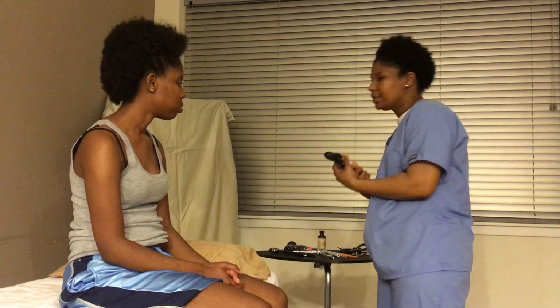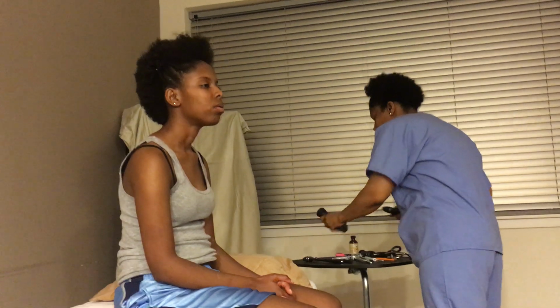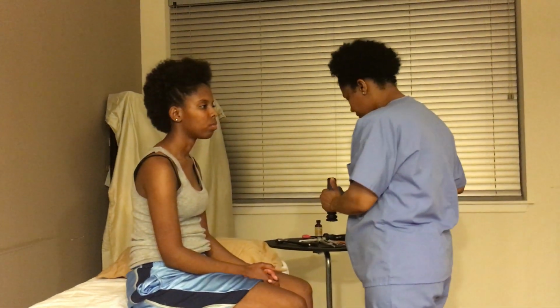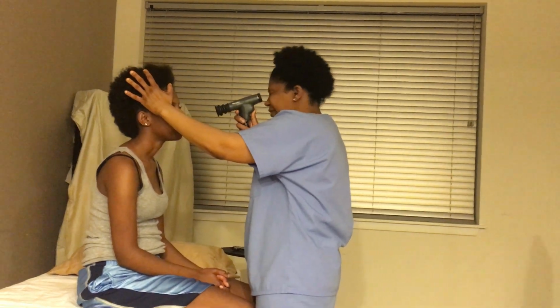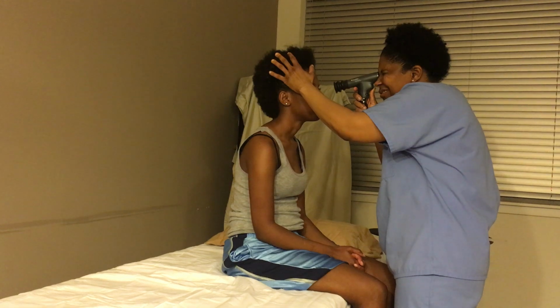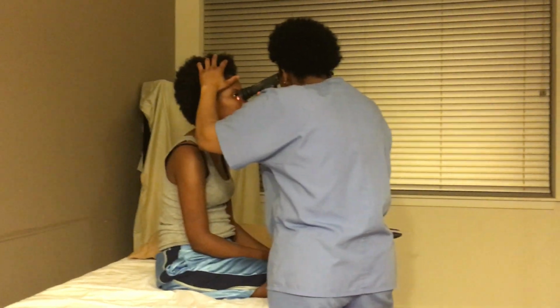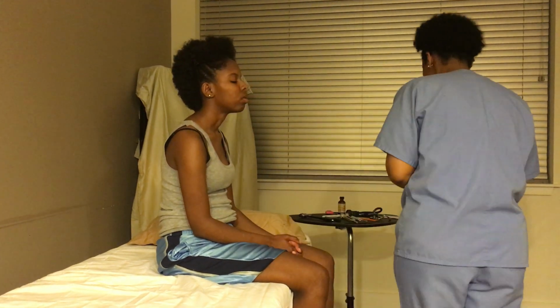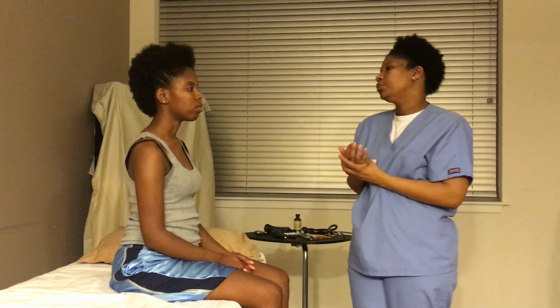Okay, the next part of the test will be the fundoscopic test, which checks the internal structures of your eye. Okay, just going to look in your eye. Looking at the back of your eye. Okay, this eye. Okay, that concludes your eye exam.